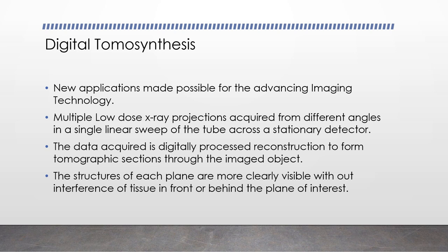Digital tomosynthesis, new applications made possible by advancing imaging technology. Multiple low-dose X-ray projections are acquired from different angles in a single linear sweep of the tube across the stationary detector. The data acquired is digitally processed by reconstruction to form tomographic sections through the imaged object. The structures of each plane are more clearly visible without interference of tissue in front of or behind the plane of interest.